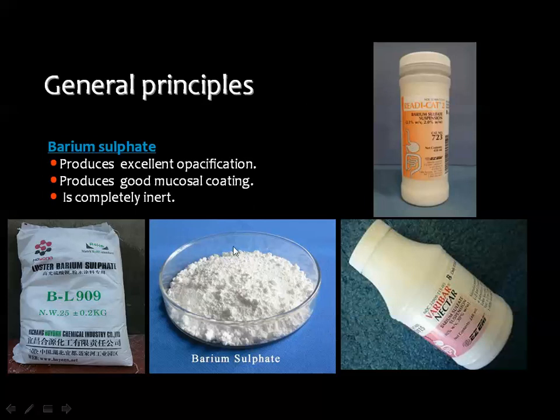Barium, which is used in the diagnostic techniques, is the barium sulfate, which is one of the best contrast media for evaluation of the gastrointestinal tract because it produces excellent opacification and good mucosal coating.